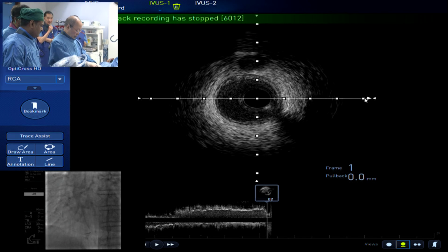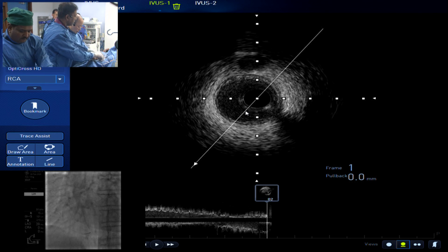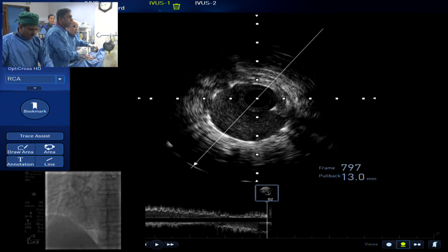Are you happy, Dr. Saito? Yes, of course. I will take the final shot, okay? Okay, great. Okay, ready? Yeah. Just this is out.